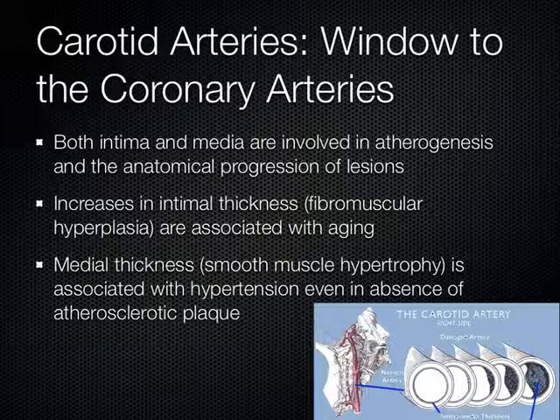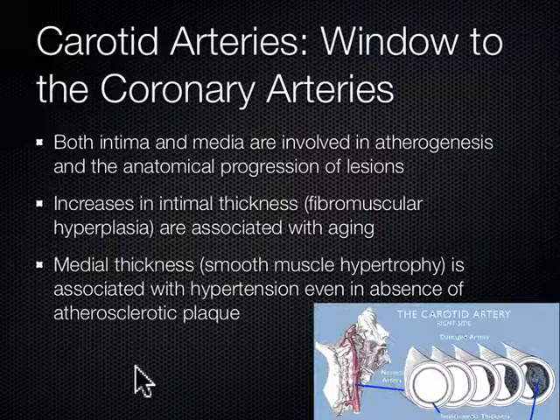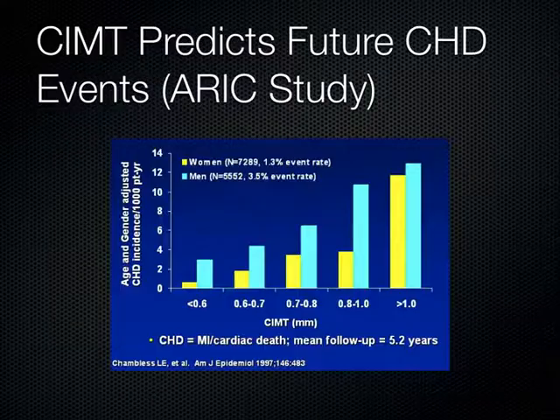So the idea is if we can identify it before it becomes really thick, then we can gauge the person for certain types of medication, anti-lipid, antihypertensive therapy, stuff like that. We can put them in a risk category. And that's what this trial did a few years ago.